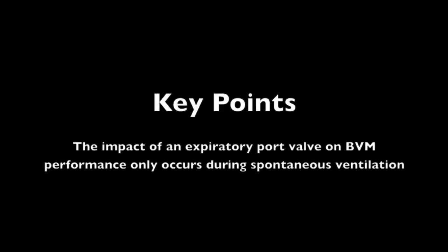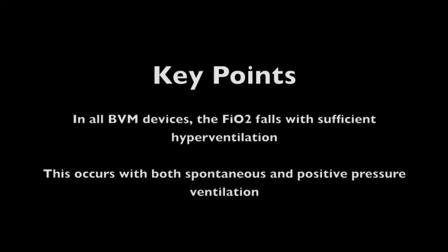The impact of an expiratory port valve on the performance of a bag valve mask device is only evident during spontaneous ventilation. With positive pressure ventilation, all bag valve mask devices provide an inspired oxygen concentration of greater than 95%, irrespective of the presence of an expiratory port valve. In all bag valve mask devices, irrespective of the presence of an expiratory port valve or the mode of ventilation, the inspired oxygen concentration will ultimately fall with sufficient hyperventilation.